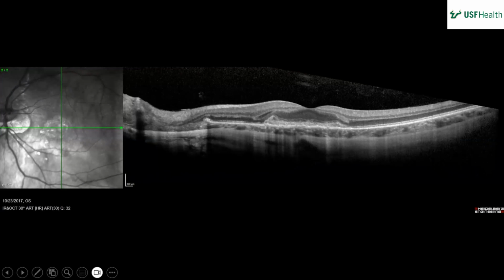Okay, I like lepto. Okay, so on this OCT of the left eye, the vitreous is clear. The foveal contour is attenuated, and centrally there's subretinal hyperreflective material. And on the left side of that hyperreflective material, it looks like, I don't know, it's mixed. There might be a little bit of blood or something in there, because there's a small spot of hypo a little bit to the right, Heidi, where it's lumpy. Yeah, there. And then you don't see good integrity of the outer retinal layers, like the ellipsoid zone and ISOS junction. And then you can see the reflectance kind of shining through because you have those outer retinal changes.